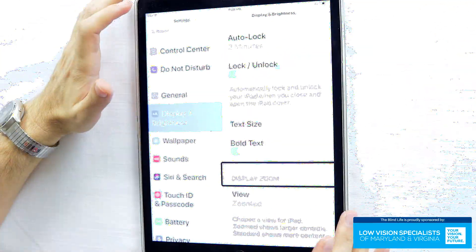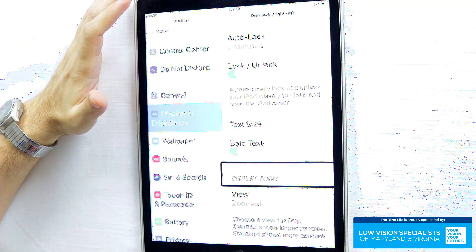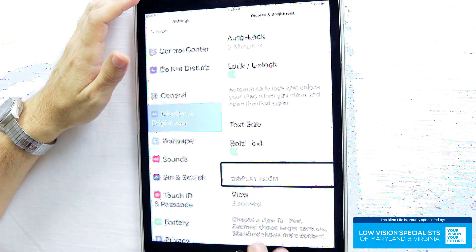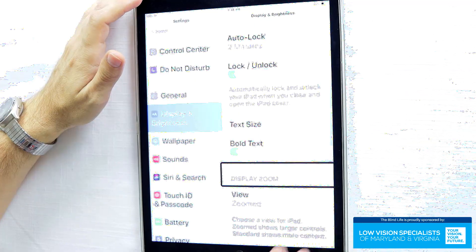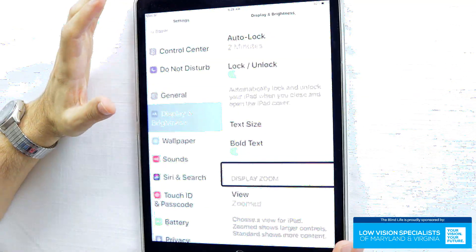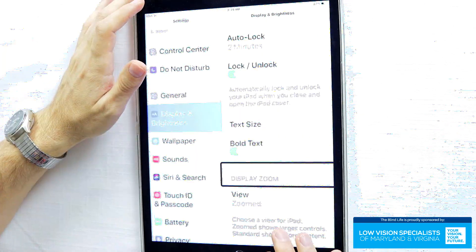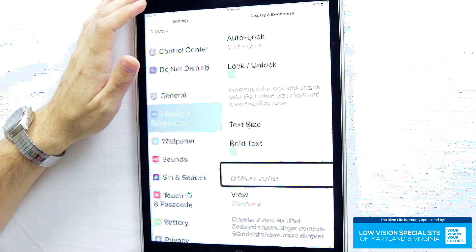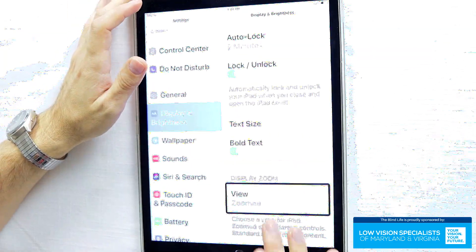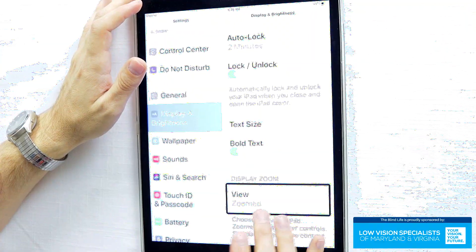Now if you're using one of the larger iPads, you may have an option in display and brightness for display zoom. That's where you can make everything larger on the screen — it takes advantage of the bigger screen. If you are using that, I recommend changing the view from normal to zoomed.